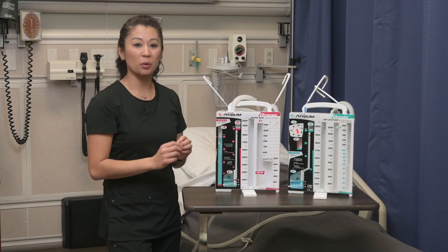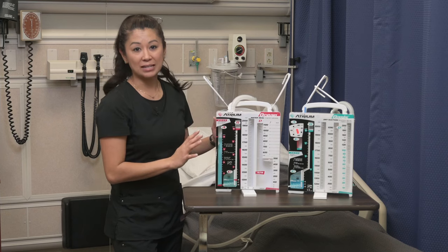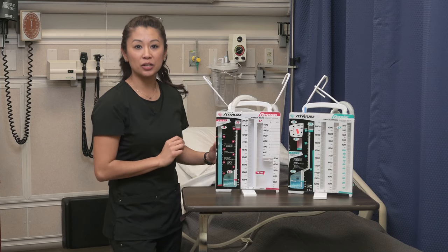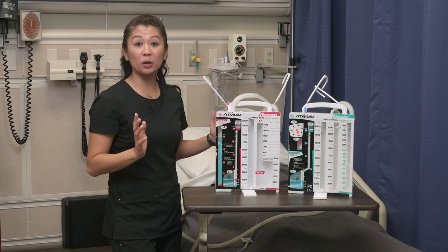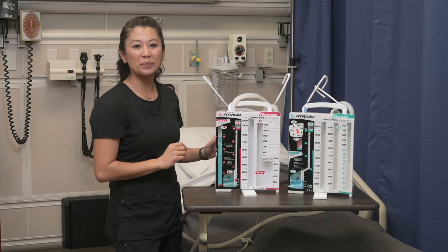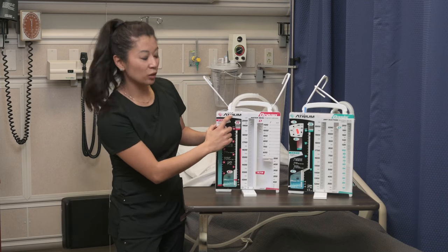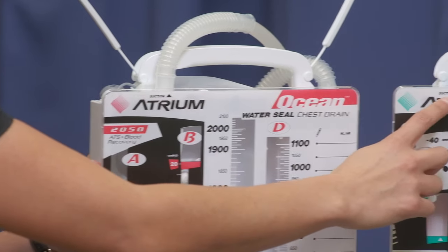One more thing — the same on each side: these chambers have a label area which makes it easy to identify the patient. When connecting the canister, don't worry about which port goes where — the equipment tells you. You'll see a mark that says 'to suction' on both the wet and the dry.